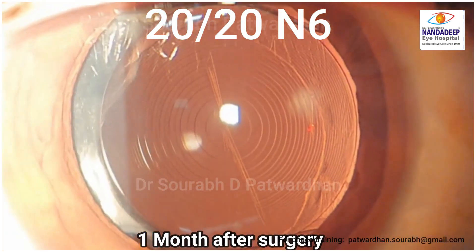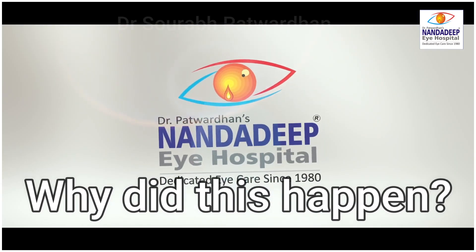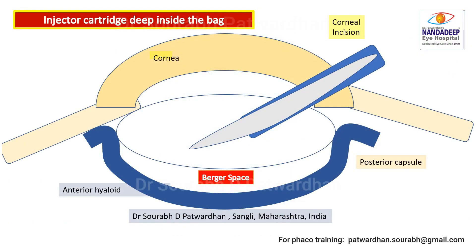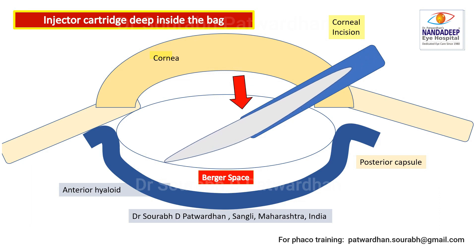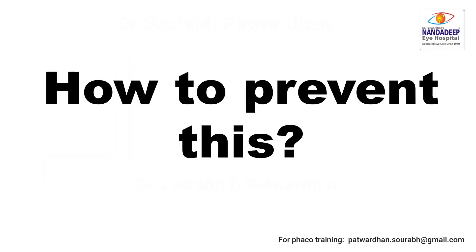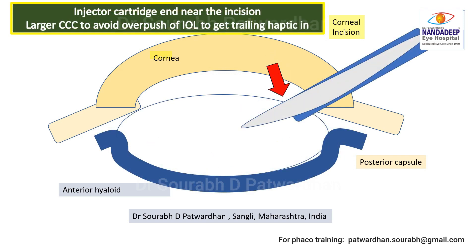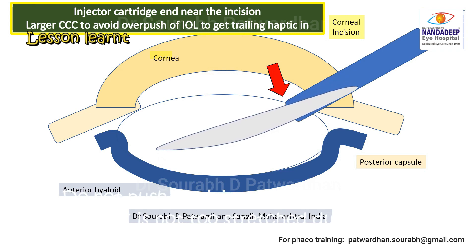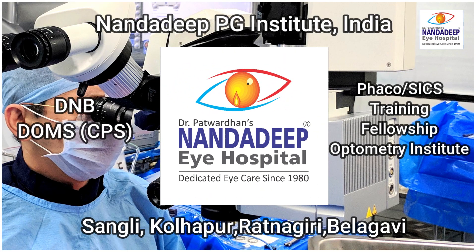Why did this happen and what should I do differently? When I reviewed the video, I realized that the plate haptic IOL is large, and the injector cartridge was deep inside the bag, giving no space for the IOL to unfold itself in the bag, so it pushed on the posterior capsule. The posterior capsule was probably separated from the anterior hyaloid, making it redundant and the viscoelastic may not have been filling the bag completely, so it dragged the posterior capsule and caused the tear. Lesson: fill the bag completely with OVD, ensure the bag is deep and fully filled, and the injector cartridge should be just inside the incision — not inside the bag — giving the IOL required space to unfold. Make sure the posterior capsule is not stretched during IOL insertion. These are the things I learned from my mistakes. Thank you.